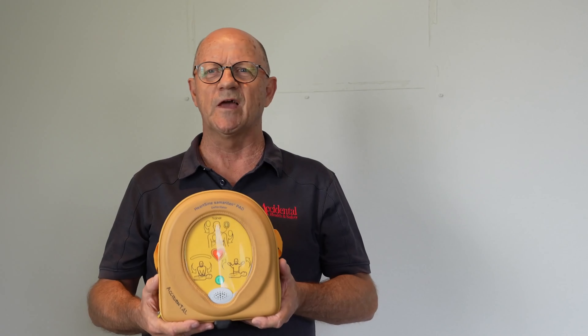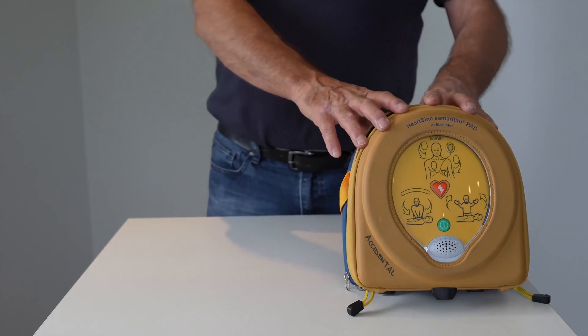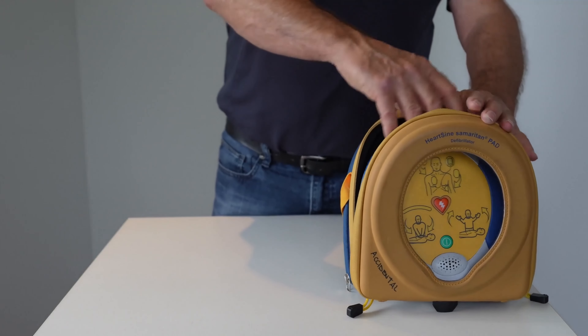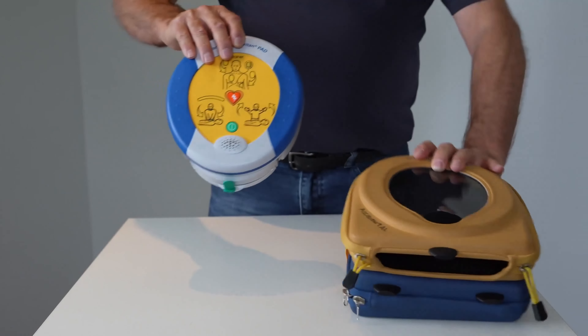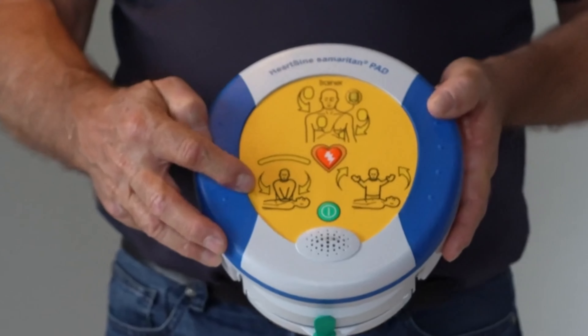Hi there, we're very excited to show you how to use a defibrillator. These compact devices are so useful in saving people's lives, and today we want to share with you step by step what you can expect and how to use one. Here we have the HeartSine 500P, and we'll take it out of its carry case. You'll note some pictures there giving us clear instructions on how to use it.